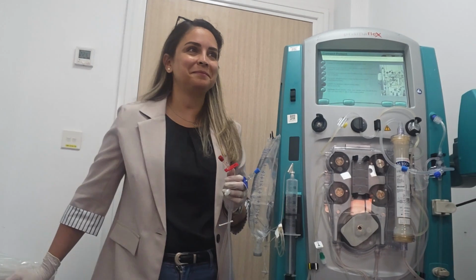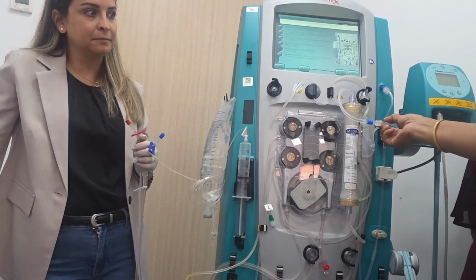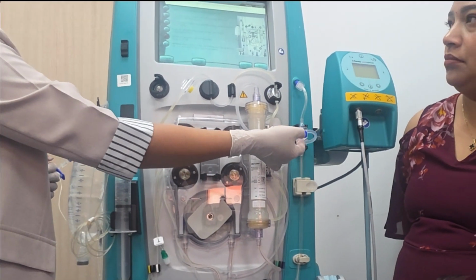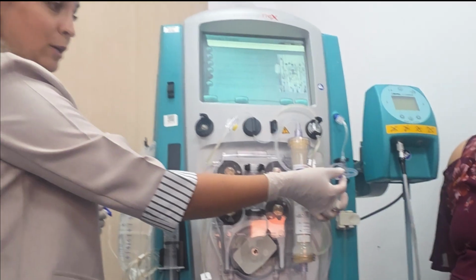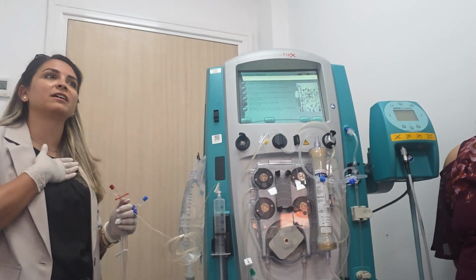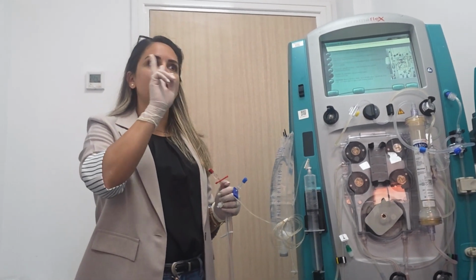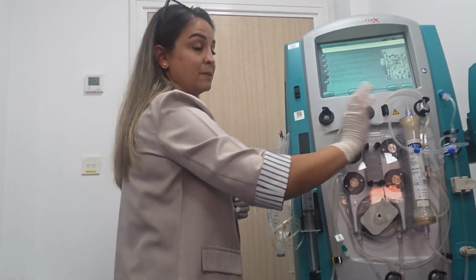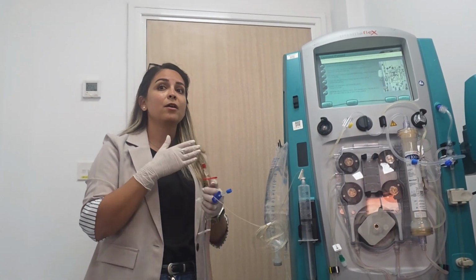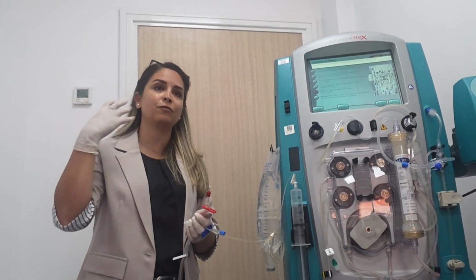We are connecting to the return line. So you can take the blood from here. This is the post filter. Okay. So you will take a sample from here, but you need another sample from the patient. Because you have two ABGs to do. One from here, this is mandatory, and one from the patient side. Okay? If you have an arterial line, it's the best one. If you don't have an arterial line, take from the central line.